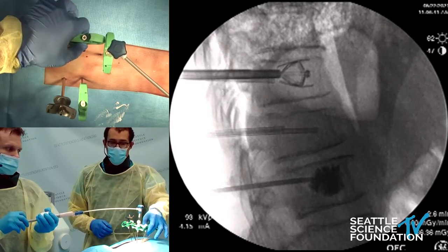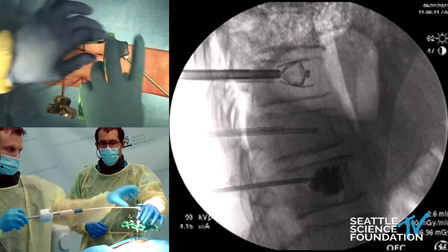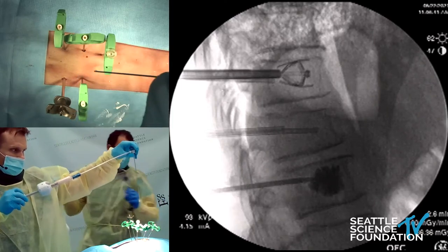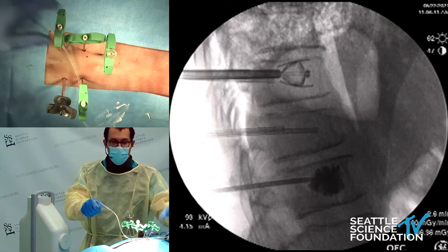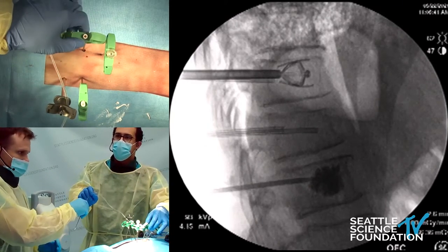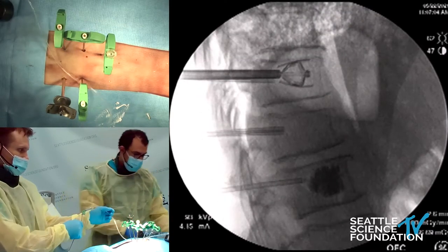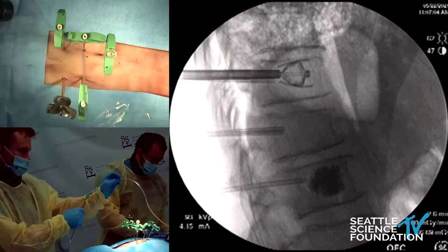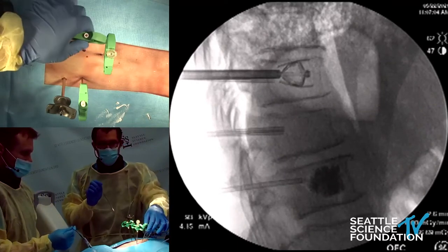We're going to switch next to a kyphoplasty technique. We've already prepared these two trajectories and we're going to be placing our balloons down. This one is a little bit of a large trajectory, so just be careful with that.